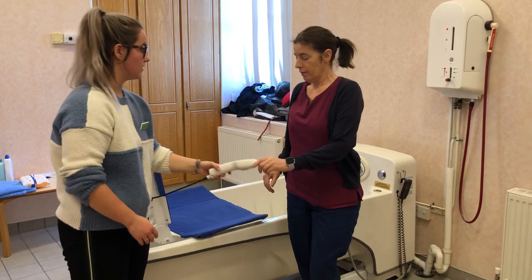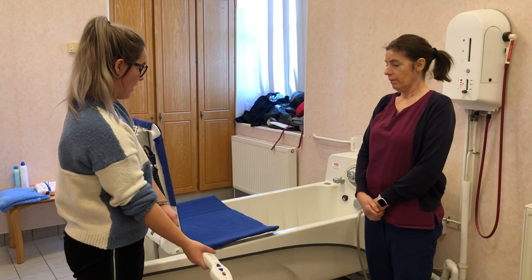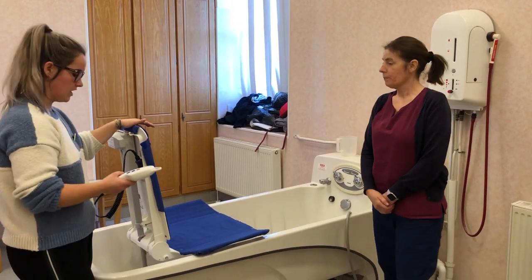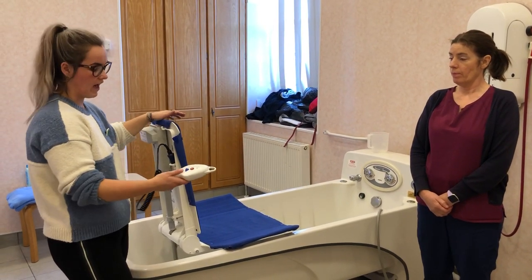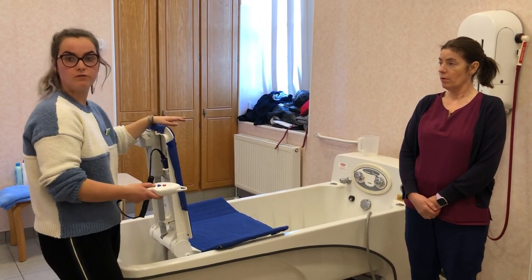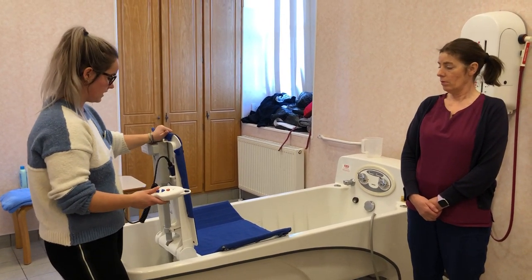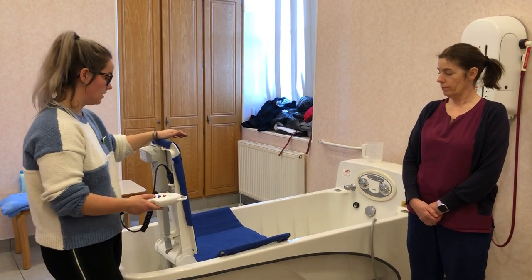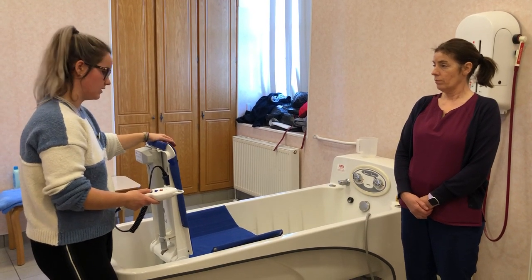If the remote ever drops into the bath it is waterproof, but we'd recommend that you keep it outside the bath while you're using it. If someone who didn't need the bath aid wanted to use the bath, the seat always has to be fully down and fully reclined before you take it apart, otherwise the backrest won't move. So it has to be the full way down before disassembly.